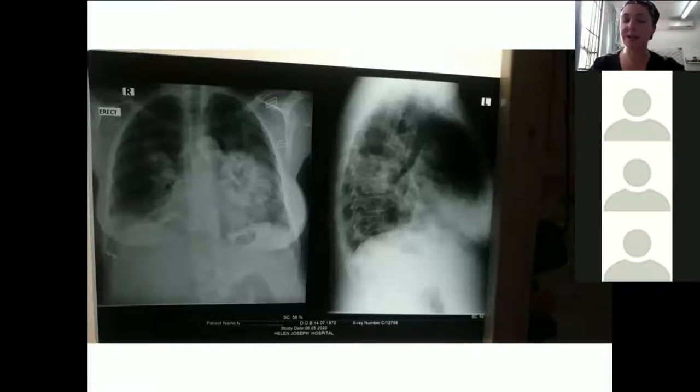And it's really interesting because that infiltrate on the left-hand side actually looks quite nice and round. It looks like it's got a shape to it. It doesn't just look like it's spread out. And that's interesting because that makes you wonder, could that infiltrate maybe be a mass in that area? And if you're thinking that it's a mass, is it a possibility that it might be something non-benign? So that's interesting. And then can you see the heart borders nicely? Not really. So really difficult on the left-hand side to see that heart border nicely. So whatever's going on in the lung field is obscuring that.